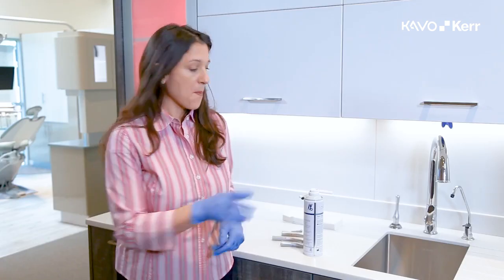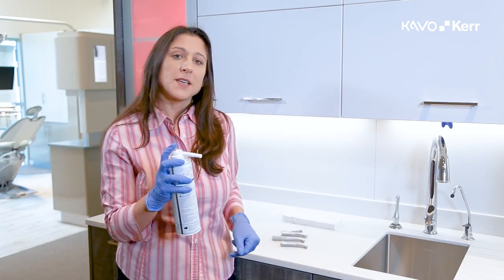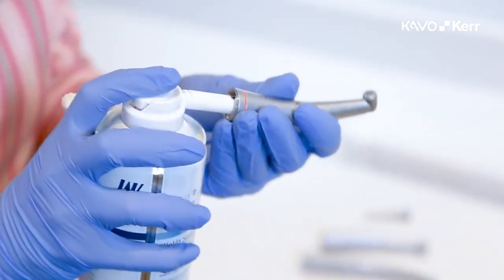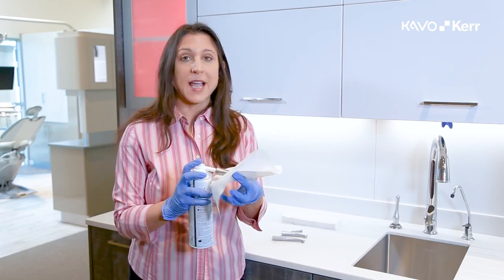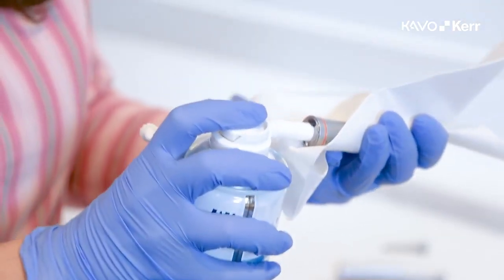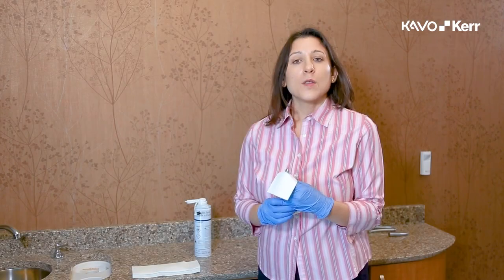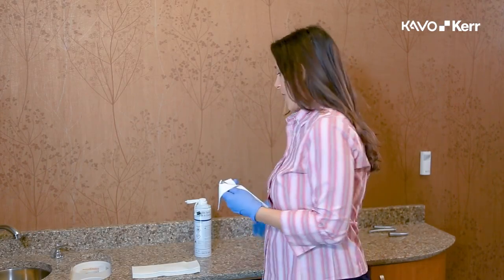Choose the appropriate nozzle for the back end of your handpiece and place the handpiece on the adapter of the lubricant's nozzle. Spray the lubricant for approximately 2 seconds. Lubricate the chuck weekly with the adapter provided with the lubricant.